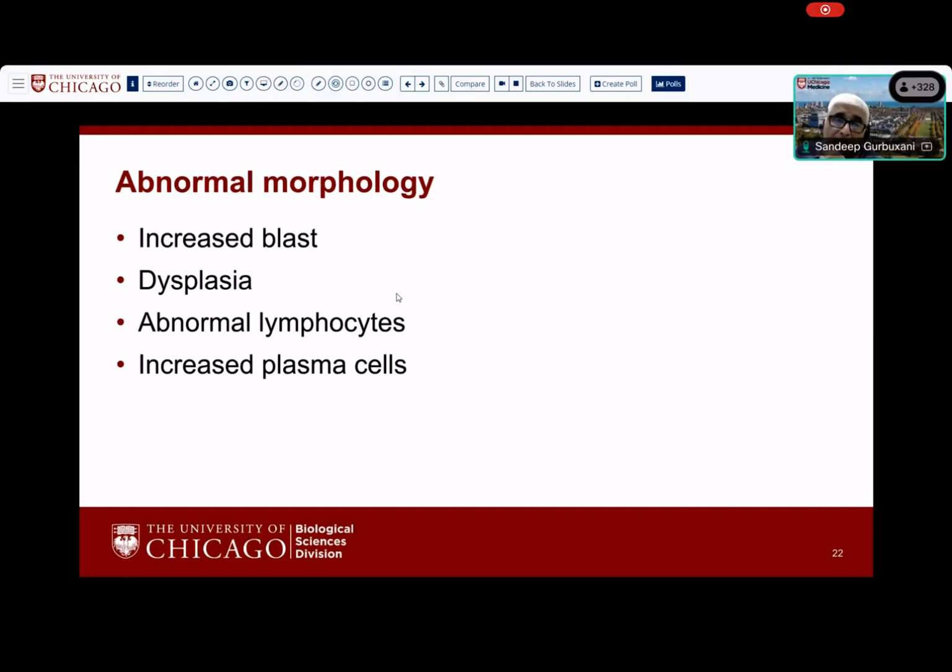And are there any abnormal components, like abnormal lymphoid aggregates that are present in big chunks or that are present in specific locations, particularly when you're evaluating the core biopsy, the intrasinusoidal or peritrabecular. So that's when the core biopsy becomes very, very critical for assessing the significance of these lymphoid cells. Plasma cells, when they're increased, you could again be dealing with something reactive, or you could be dealing with a malignancy of plasma cells. You could be even dealing with a malignancy of lymphoid cells that differentiate into plasma cells and have this lymphoplasmacytoid morphology.